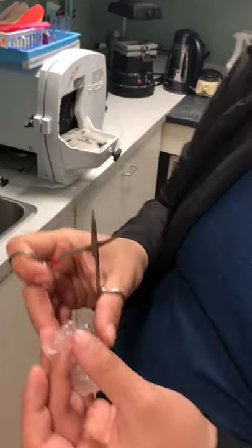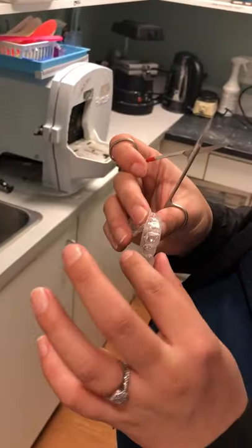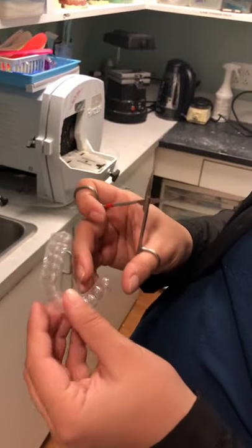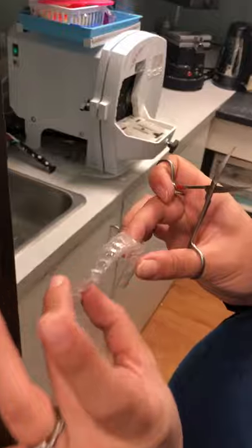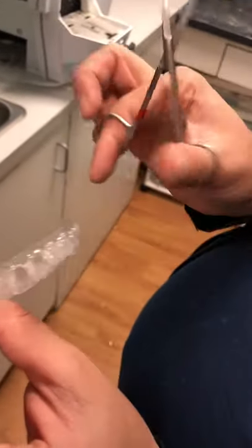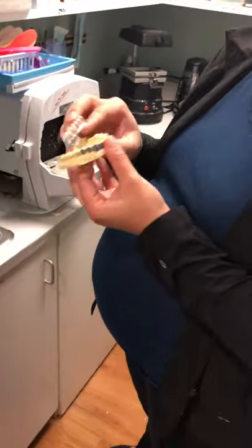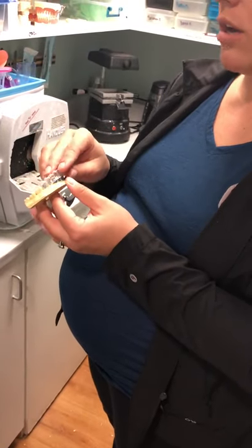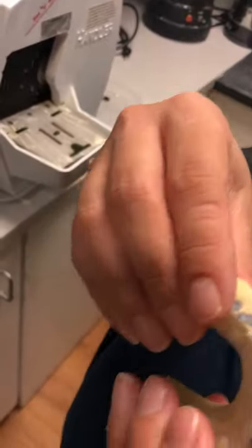Sometimes people even go to the first molar. The biggest thing is you want to make sure there's no sharp edges, pointy edges, or excess around — just looks pretty even, that one to two millimeters around. And then you can try it back on your model if you want to, or if you're making your own, you can try them in your mouth, feel around with your tongue, your lips, and see if it's comfortable.